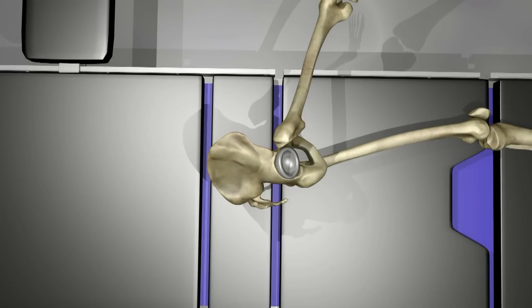A plastic liner is placed inside the metal acetabular component. This keeps the metal components from scraping together.